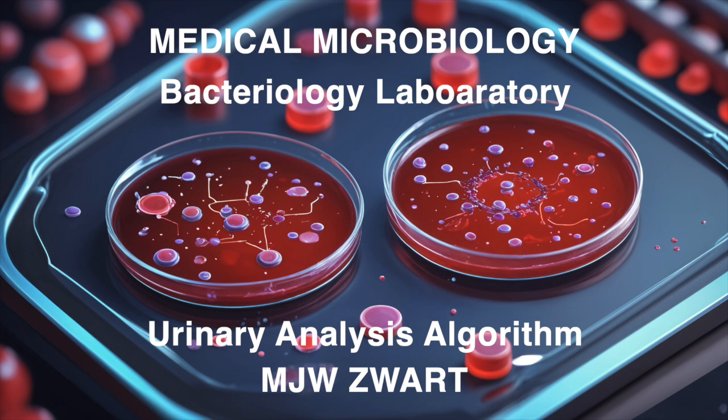And they even have specific guidance for MRSA, another tricky bacterium. But what's fascinating is that they acknowledge the limitations of automated systems, like the VITEK 2, and emphasize the importance of additional testing in certain cases to confirm resistance.